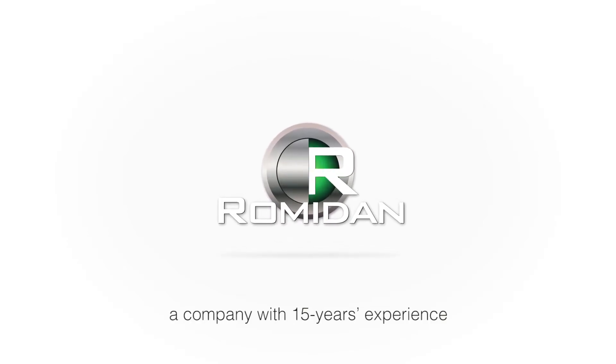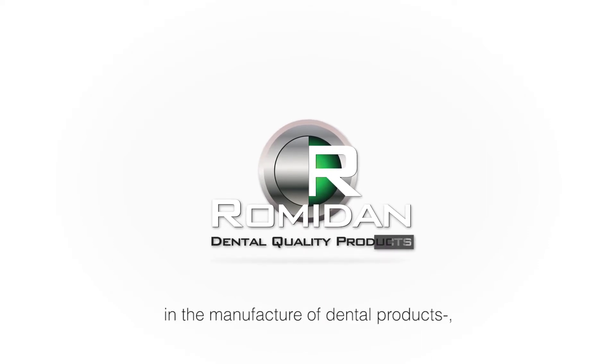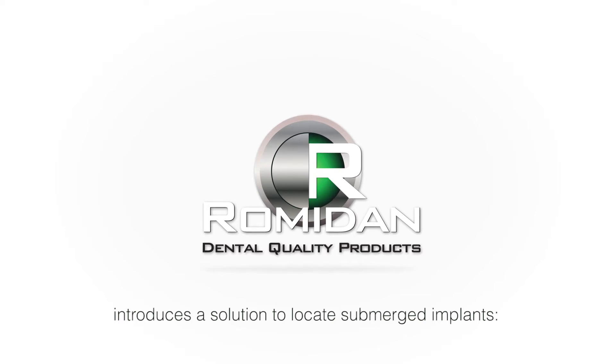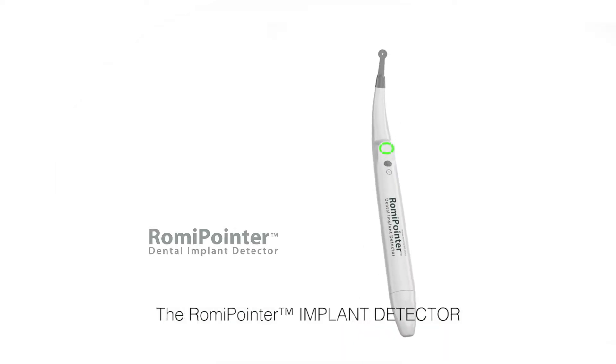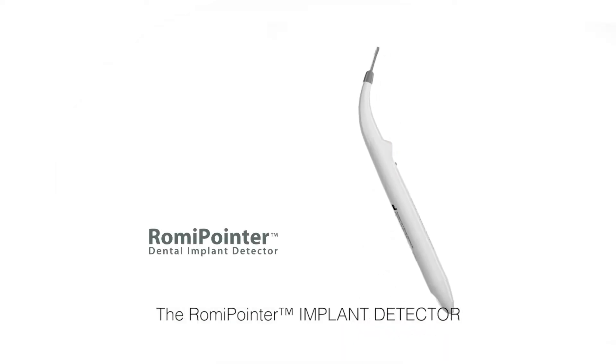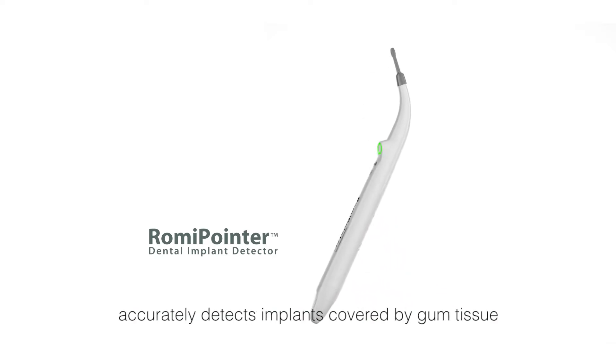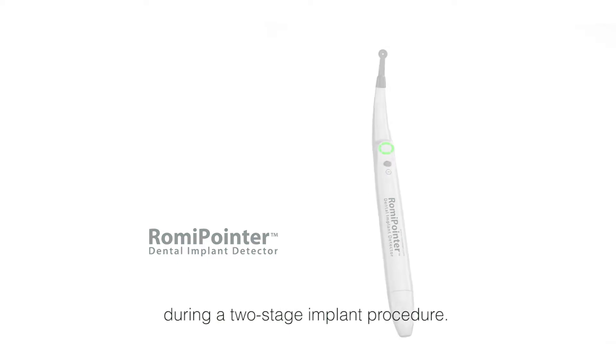Romidan, a company with 15 years experience in the manufacture of dental products, introduces a solution to locate submerged implants: the RomiPointer Implant Detector. The RomiPointer Implant Detector accurately detects implants covered by gum tissue during a two-stage implant procedure.